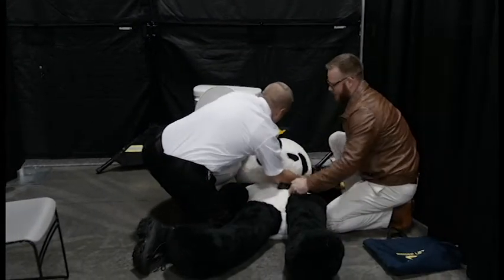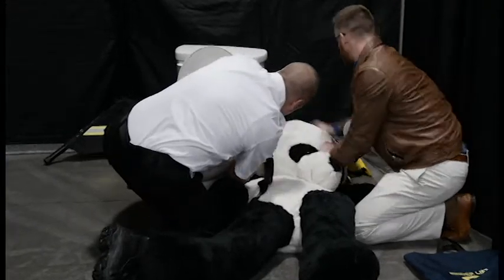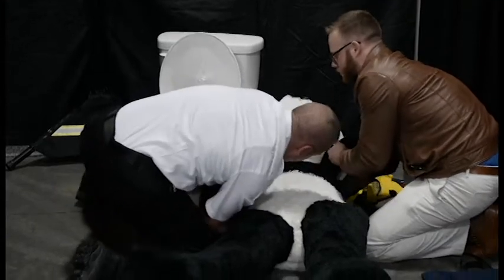When your patient is in this position, you're going to put the Bender lift behind the patient's head. You're going to grab the bottom of the Bender lift and you're going to start working it down underneath the patient's shoulders.